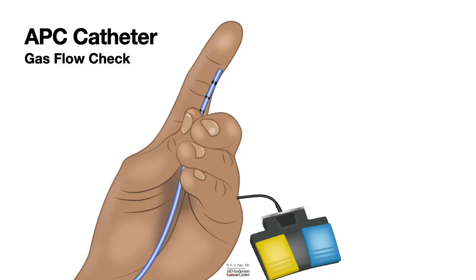To check gas flow, press the blue pedal and feel the gas on the tip of your finger — if you feel it, you are set. In previous models, people used a separate system to check whether the circuit was complete, but that is now part of the machine.